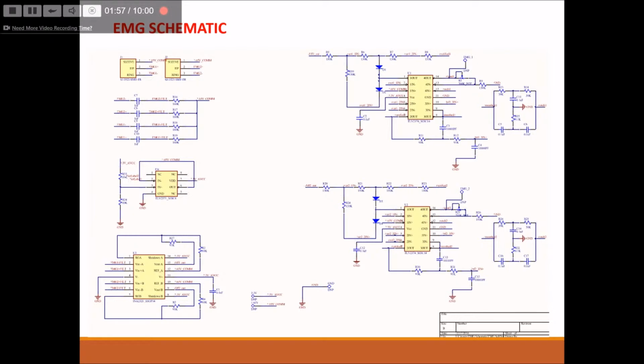The main parts of the circuit are the rectifier, which I am circling right now with my mouse. And then we come down and we have an enveloping circuit. And then we have a 60 hertz notch filter. And then we have a programmable gain amplifier at the very end. And this is the same for both channels. We also have a COM generator because we are powering this circuit with 3.3 volts, and the COM generator outputs about 1.65.